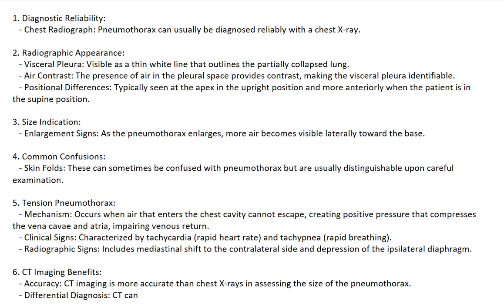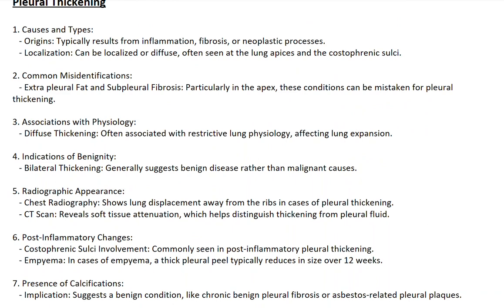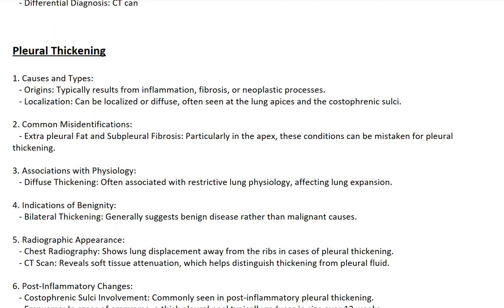6. CT imaging benefits. Accuracy. CT imaging is more accurate than chest X-rays in assessing the size of the pneumothorax. Differential diagnosis. CT can differentiate between a loculated pneumothorax and bullous disease.